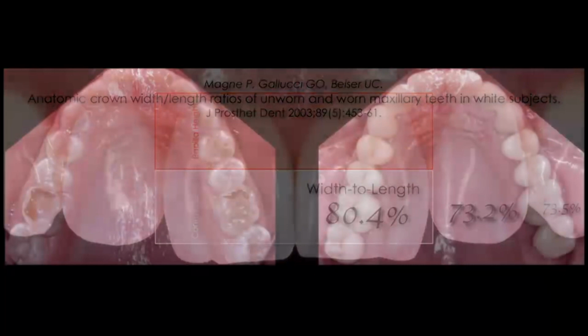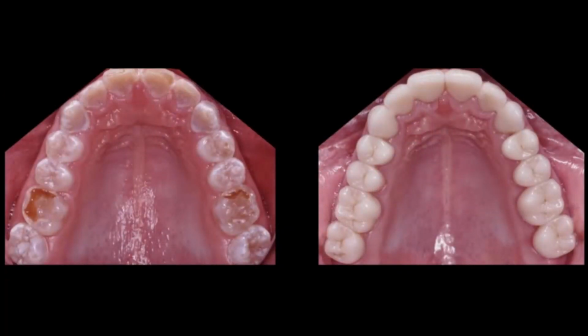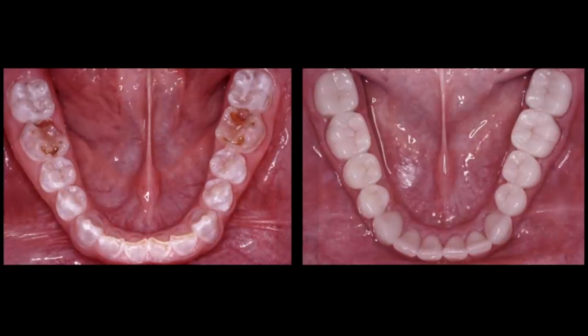Very important information. So Oliver and me, we restored a lot of cases. I would guess about 10 complex cases in the last, I would say 7-8 years. And this case actually was one of our first. That was a patient with a dentinogenesis imperfecta. And you see him at the age of 14, 15 on the left-hand side. And we did a try-in in 2006. We did a test drive with the provisionals, which were made out of a new polymer, which was experimental at this stage. And then finally we turned that into the final restoration.